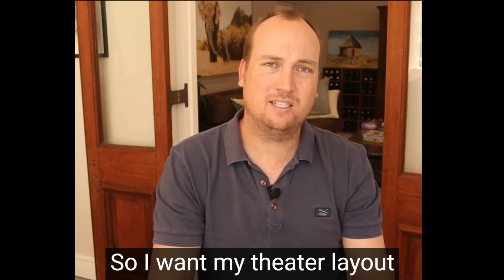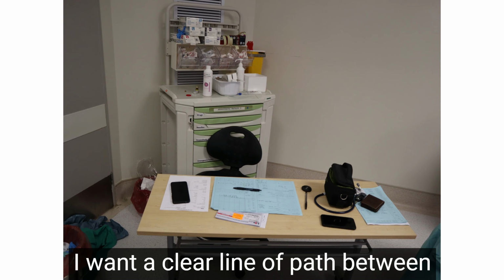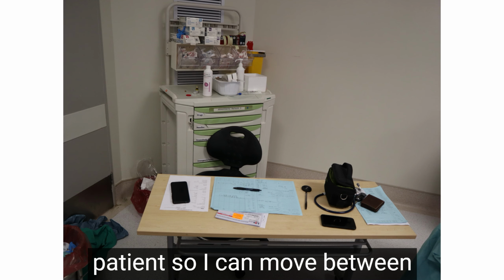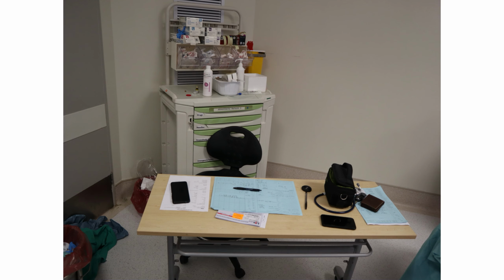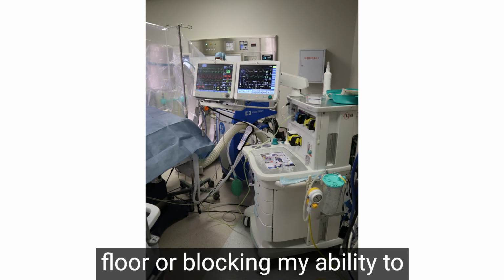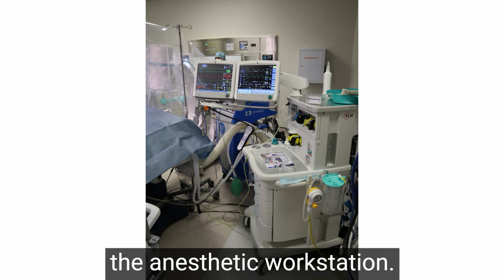So I want my theater layout to be clean and organized. I want a clear line of path between my anesthetic trolley and the patient, so I can move between the two safely and quickly. In particular, I don't want cables and tubes and pipes on the floor or blocking my ability to get to the patient's airway or the anesthetic workstation.